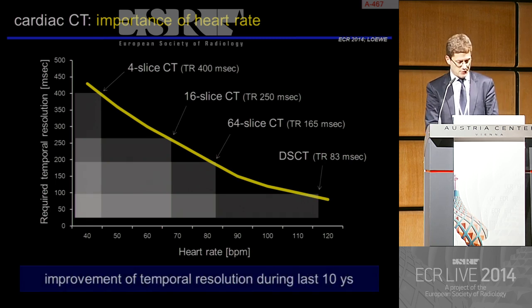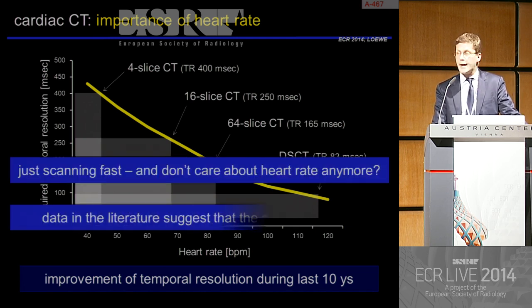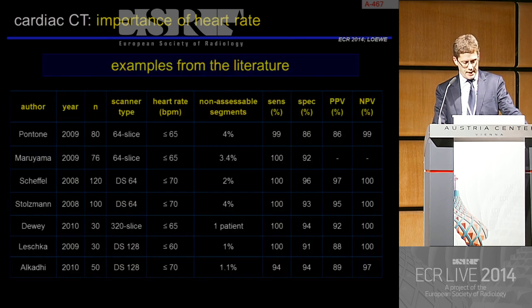So the question is, is this enough? Can we forget all about the heart rate if our scanner is fast enough? If you look again at the literature, it seems that the answer is still no. The temporal resolution is very, very important, of course. However, it's not the only thing. We still need to look at lowering the heart rate as well.